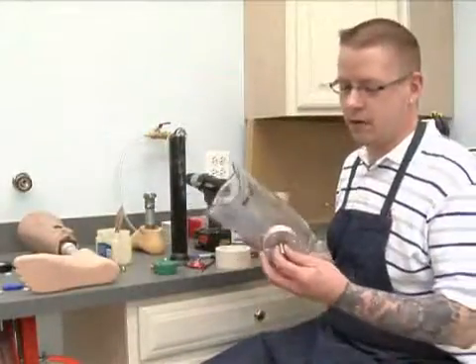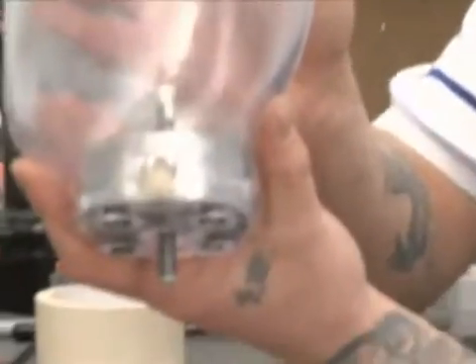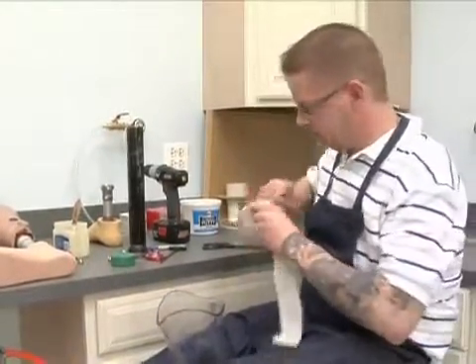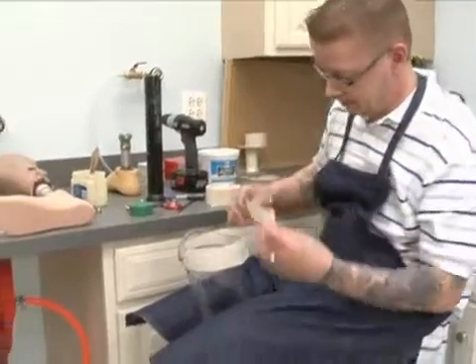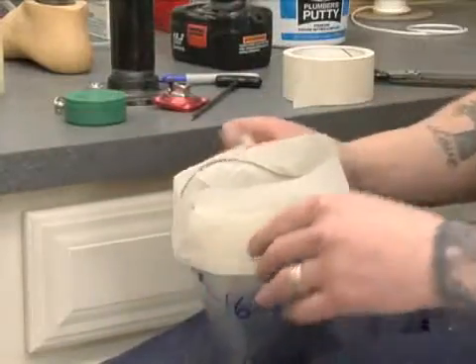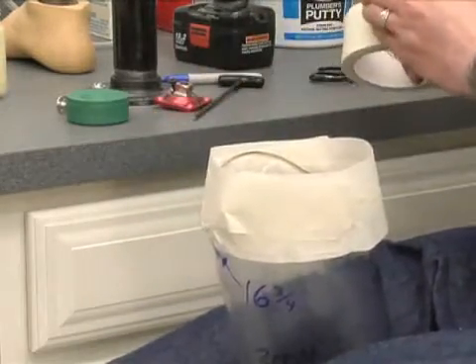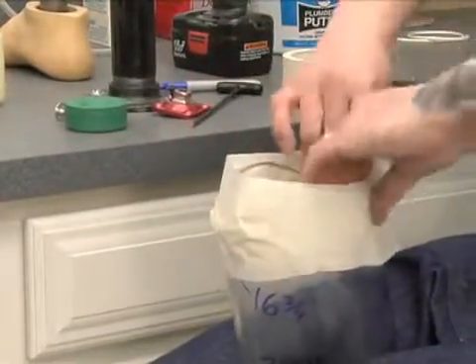We'll go ahead and give our dummy a test fit in the socket just to ensure a proper fit, like so. Now we'll go ahead and start taping up our socket so it can be filled with plaster.